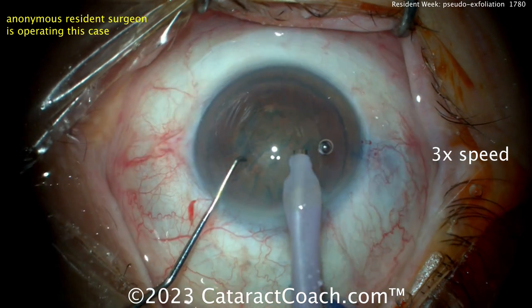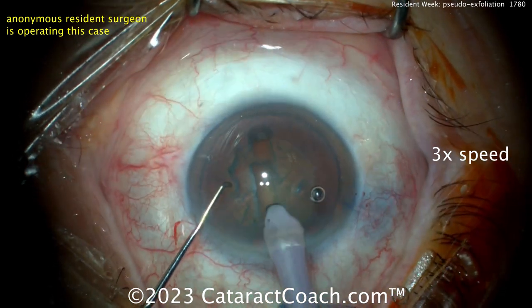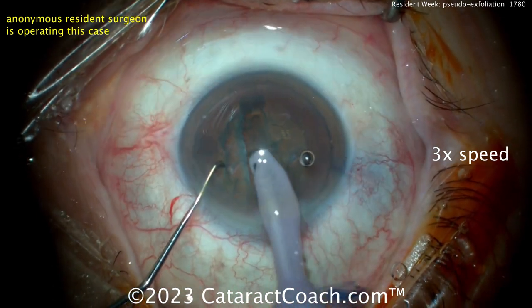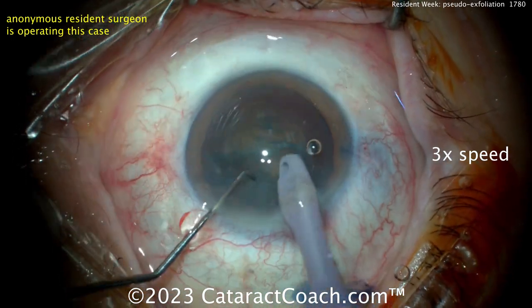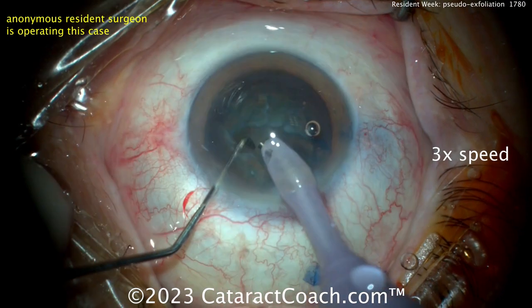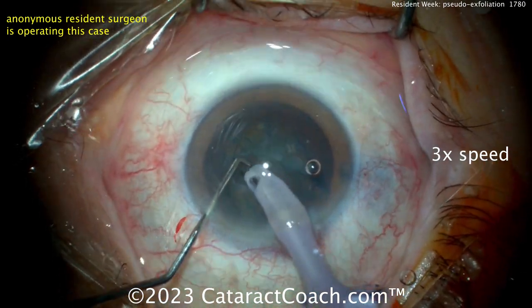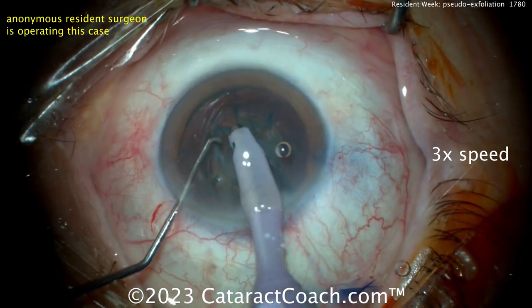Let's see the technique here — cleaning up a little bit, a little groove down the middle. Maybe a stop and chop. Finishing that groove — good depth there, that'll probably do it. And then a crack — beautifully done. And propagating the crack: take your time and propagate that crack all the way through. Make sure you really have two complete heminuclear pieces.